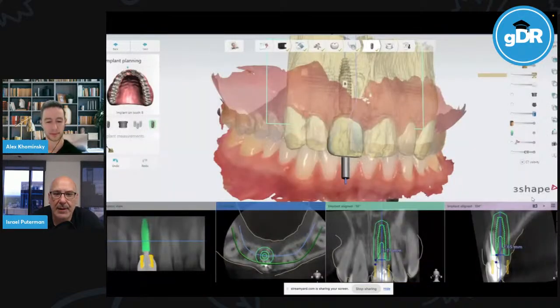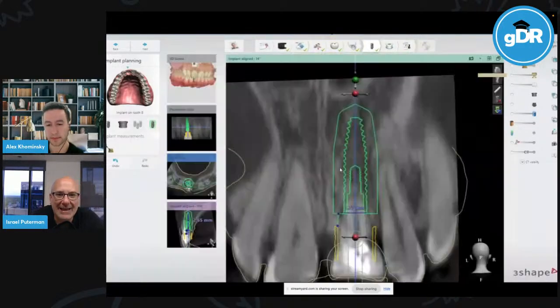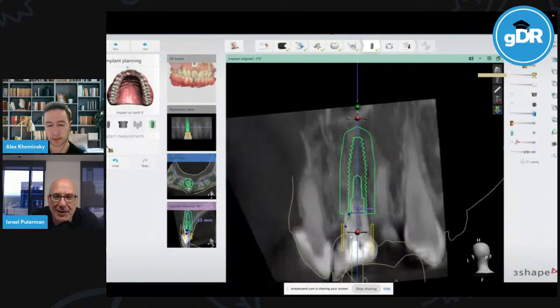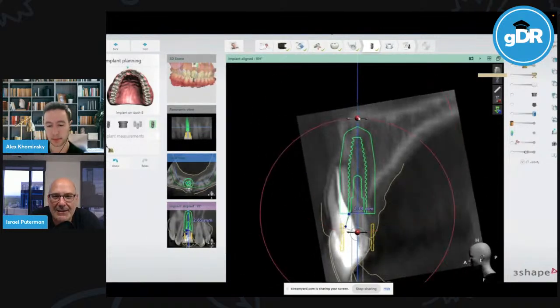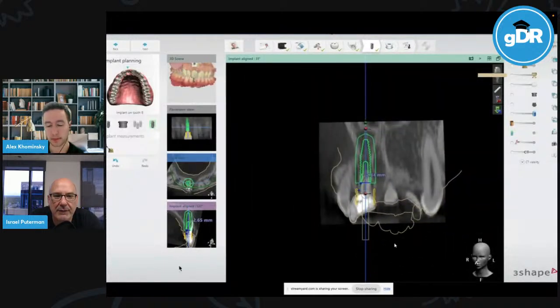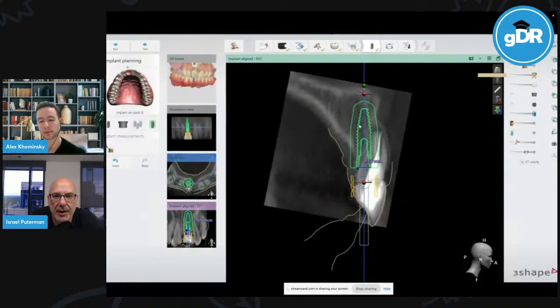So I go ahead and plan my surgical guide with my lab, and I meet with my lab every Monday after work, and we go through a bunch of cases. They have it preloaded onto the software. They set up exactly where they think the implant should go, and then I tweak it. I tell them, no, just move it a little bit more mesial, a little bit more distal. Typically, I tell them to put the implant a little deeper. And you can appreciate over here the facial position of the root. That gives me a lot of good palatal bone to work with.